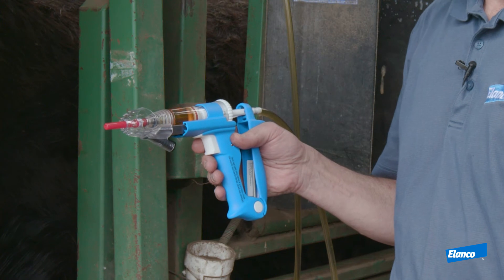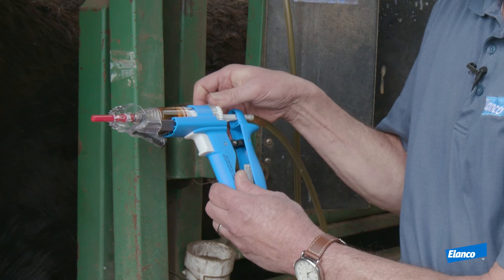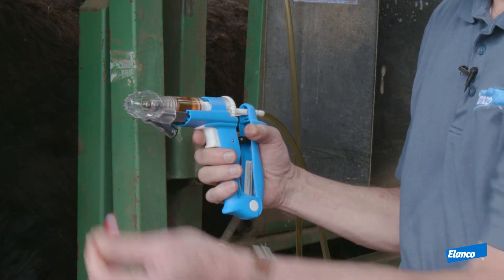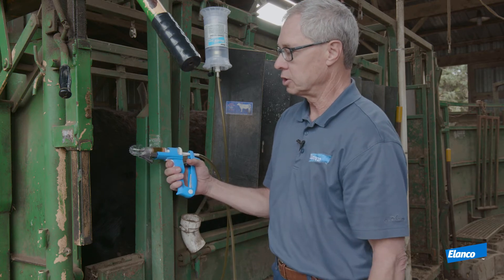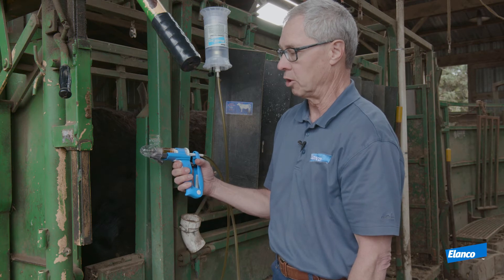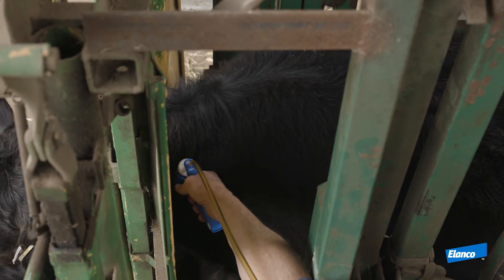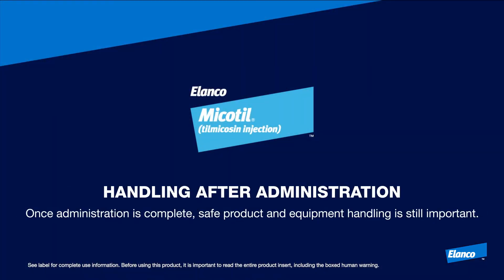Now I'm ready to inject the animal after I remove the needle cover. The next thing we do is set the dose on the wheel for the appropriate dose for this animal — you can see it right through the window. I'm going to remove the needle cover, depress the trigger, and when the cone touches her skin, the sharp points on the cone will grab her skin and automatically tent the skin so I can give a subcutaneous injection.